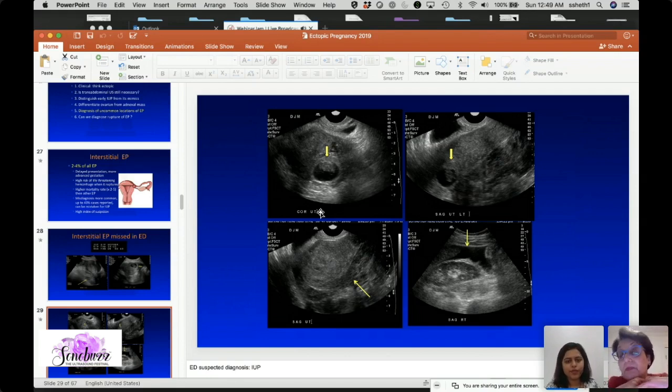Okay, ma'am. Because the only two things that are going to give you hyperstimulation are either gestational trophoblastic disease or fertility treatment. The other thing is, I've once seen a choriocarcinoma with hyperstimulation, though it's very uncommon. So always look at the uterus very carefully to make sure that there's no mass or something funny in the endometrium of the uterus.